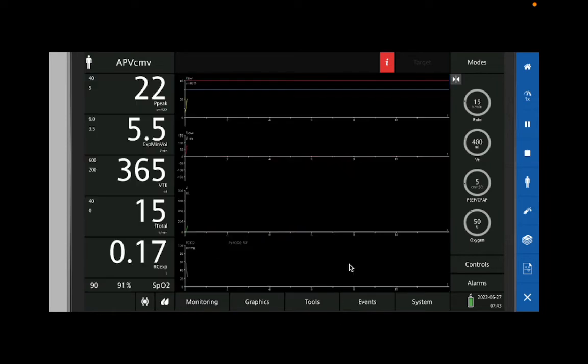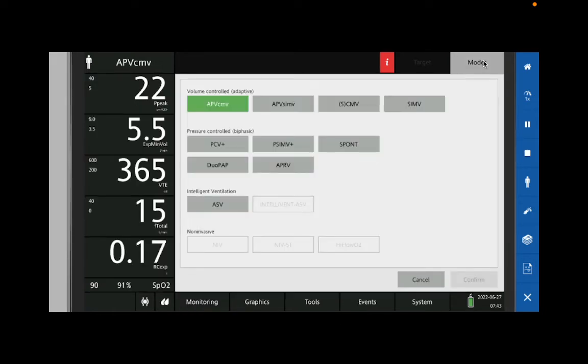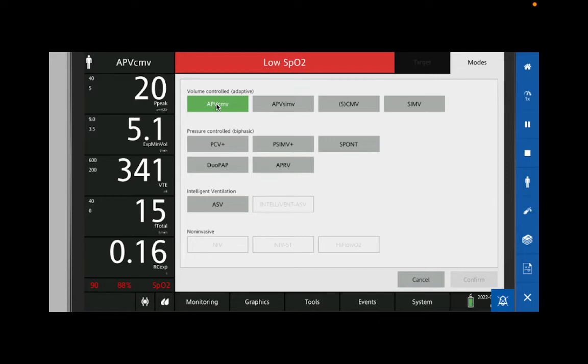So let's say we're starting up ventilation for a patient with ARDS. What mode do you guys want to do? AC. Then what? The nurses put some settings in. Your patient's already desaturating. What mode do you guys want? PRVC? Okay, that's this one. You don't need to remember that.